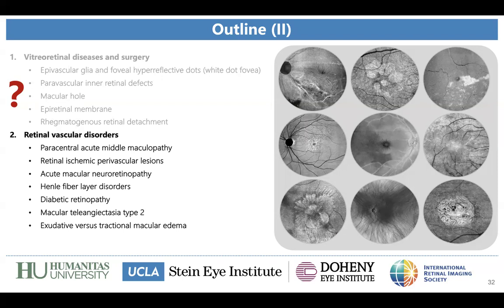I remember that we used to make measurements of those ellipsoid areas, because when you're using just a B-scan, a cross-section, you're not going to have the whole idea of the whole extent of the ellipsoid zone. So I think it's really important for following patients with those kinds of diseases. And on top of that, for research, when you're studying new drugs, etc.